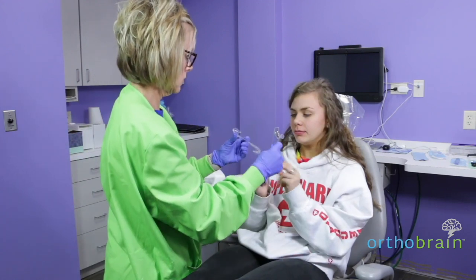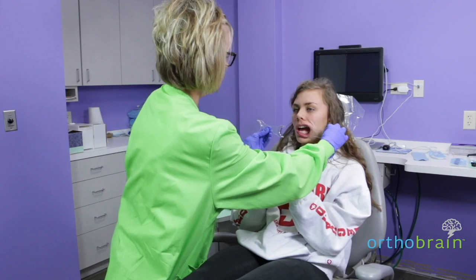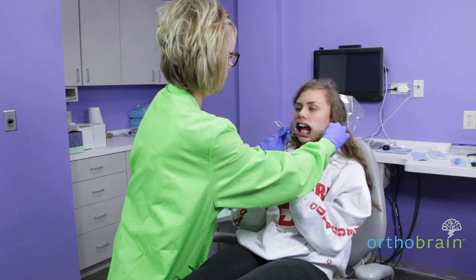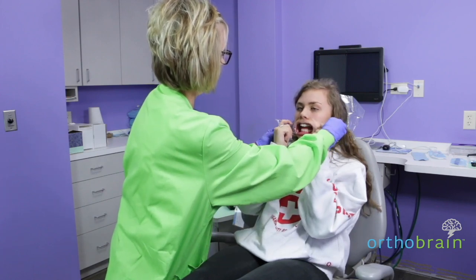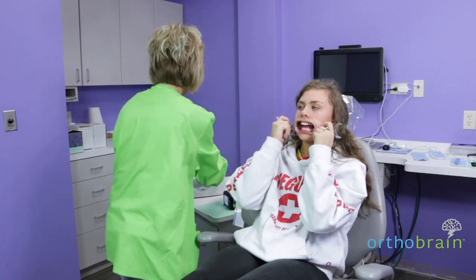I want you to put the small ends on both sides — one here and one here. Hold those for me. The mirror has to be warm so that it doesn't fog up when we take the picture.